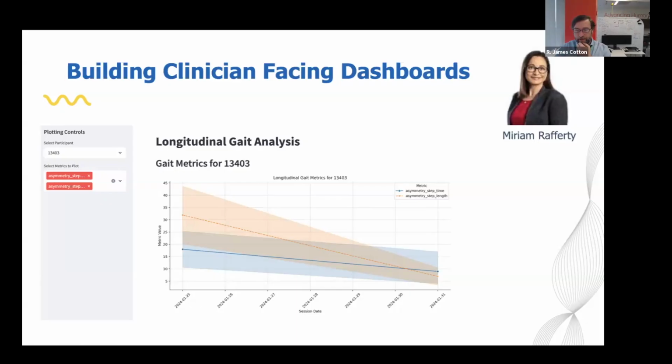Most of the work I showed you today, and what you'll be using in the notebook, is this MuJoCo model, which is derived from the Hamner model in 2010. In that one, we don't have any sex-specific model. Then when we go to the whole body tracking, we're using the MyoSuite's myoskeleton model. That one has 150 degrees of freedom, including full articulation of the hands on both sides. It is in that 2024 paper on differentiable biomechanics. We don't see a big difference in the gait parameters, at least between those two methods.